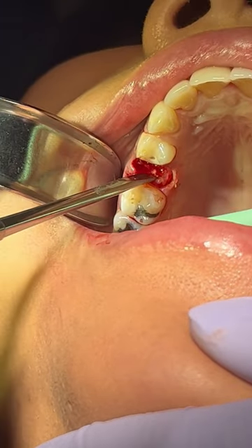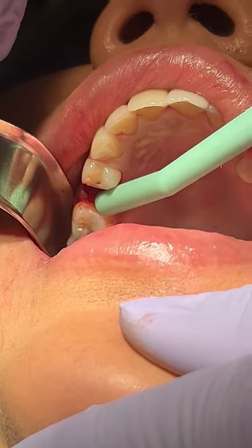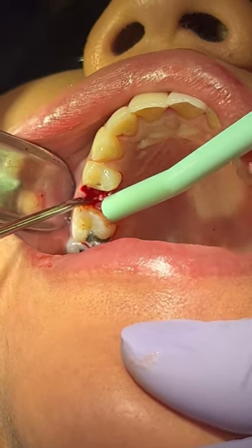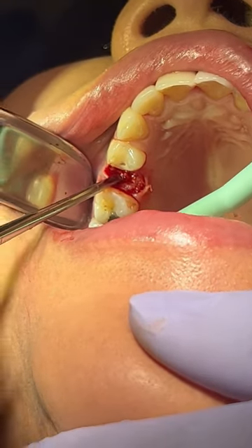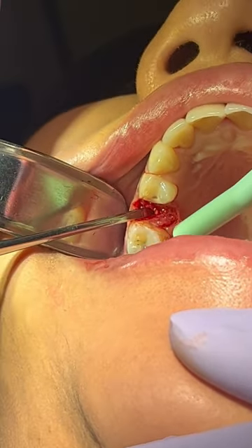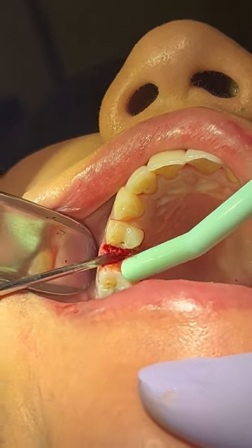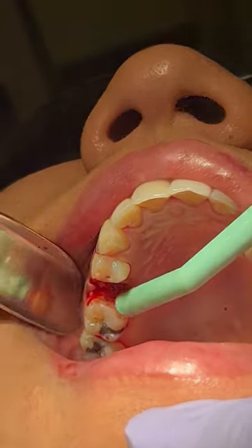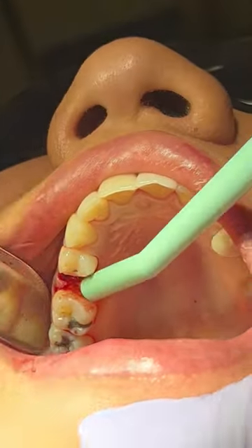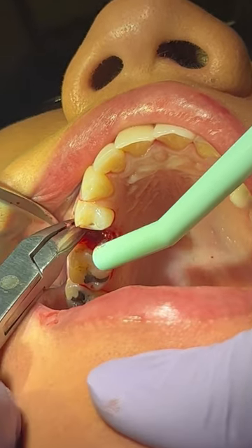Now you can see I'm just trying to find some elevation, some purchase point. I'm going parallel to the root surface into the PDL space and I'm switching luxators from the bigger one to the smaller one. As you can see, I just released it and now it's loose. Once it gets loose, you really want to make sure that you can elevate it out of there without breaking it. So then I went and grabbed my rongeurs and sure enough, grabbed it and it came right out.